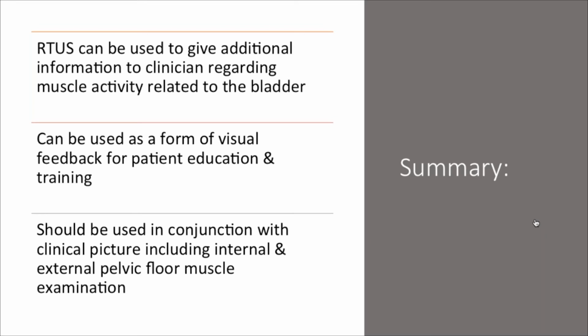So, the times when to refer to a pelvic floor PT: if you do have musculoskeletal ultrasound imaging access and the techniques that you typically would utilize are not allowing or not promoting change in the function of the pelvic floor that you're looking for, make sure that you ask those questions. Are they having pain with intercourse? Are they having any loss of control of bowel or bladder, or urgency or frequency? And get used to asking those questions and making it very normal and comfortable both for you and your patient.